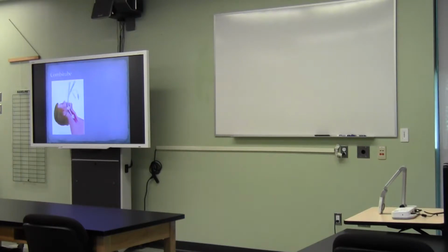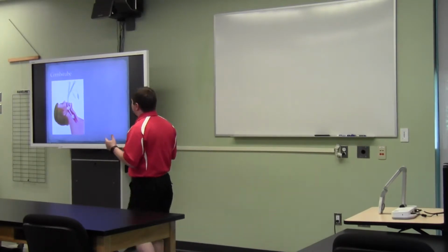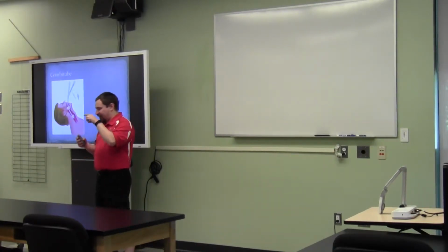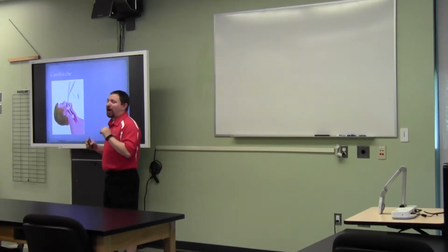Okay, so this is what I learned on many moons ago as an EMT, because this is what we had. It has 2 tubes up top, but it fuses into a single tube below. You'll see these when we get to play with them a little bit later. So the idea is that you hoped and dreamed that you would end up in the trachea and essentially be like an intubation. The problem is that no one could ever do it.